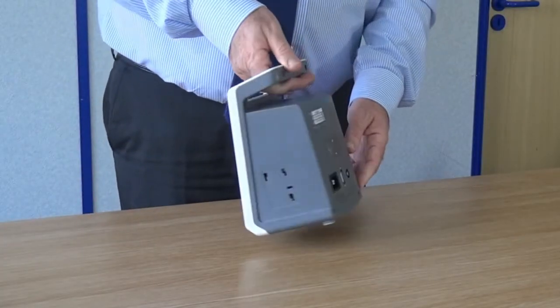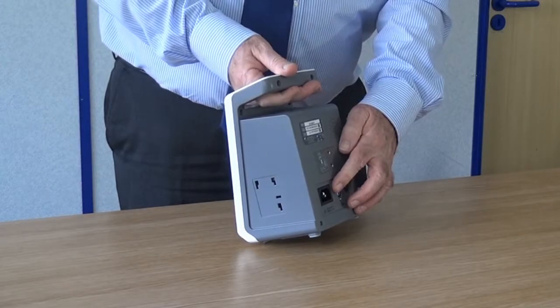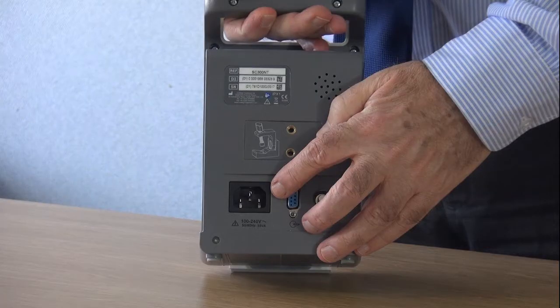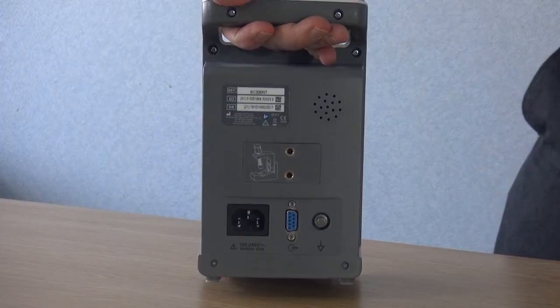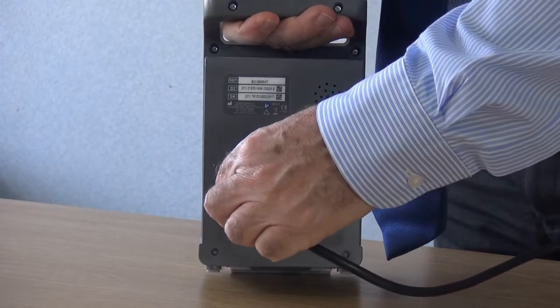The SC300NT can be operated from the local mains supply. The main power input socket is mounted on the rear of the device. Take the power cable supplied with the unit and connect it to a wall socket.